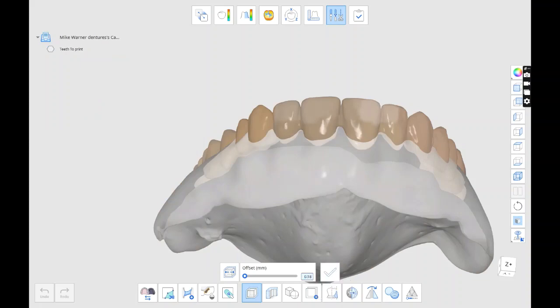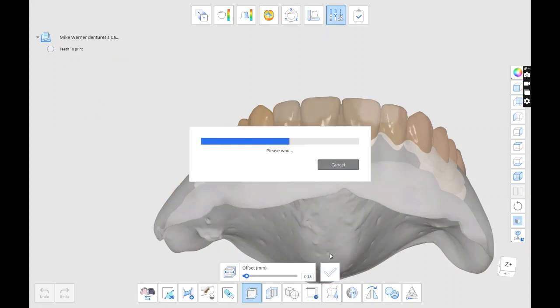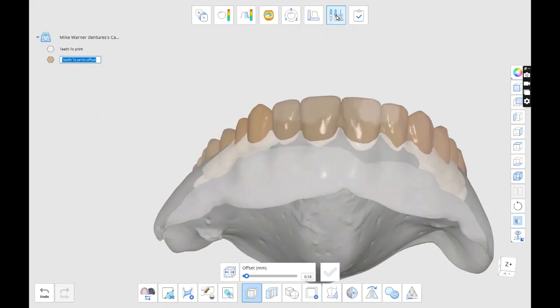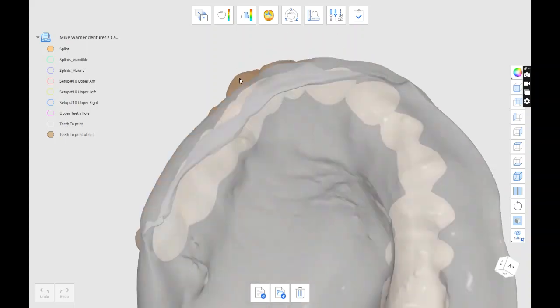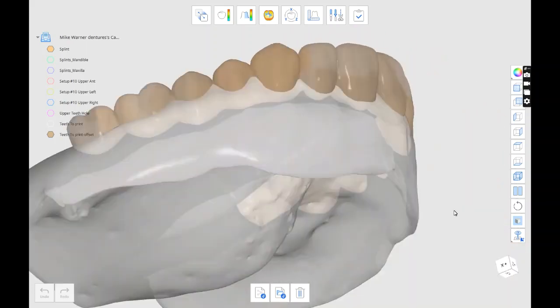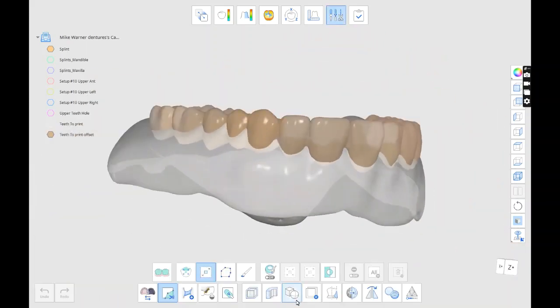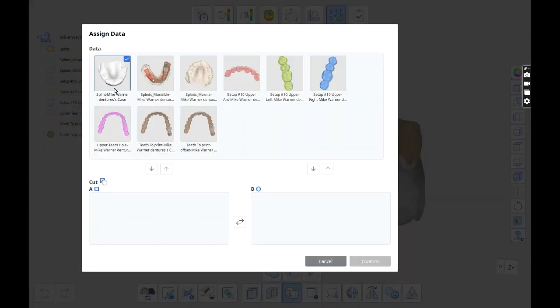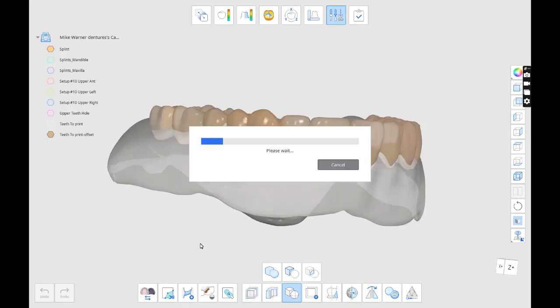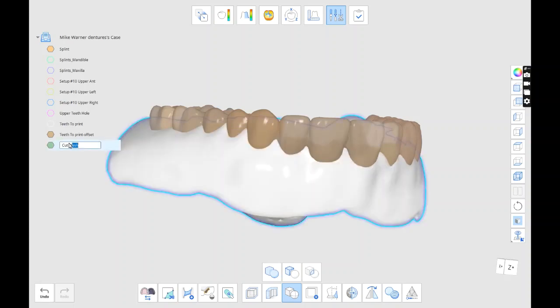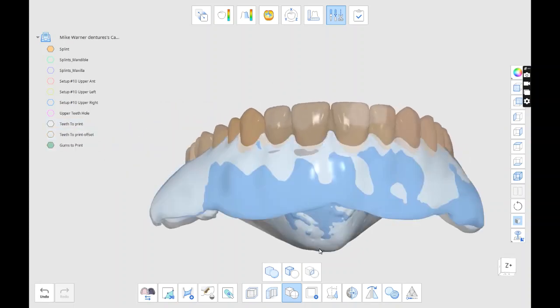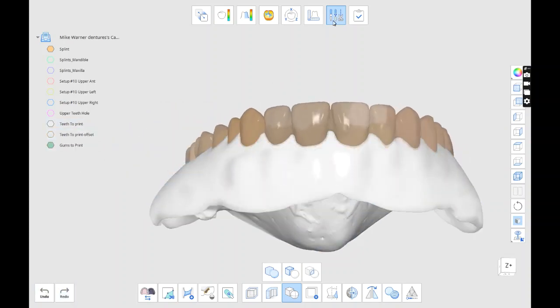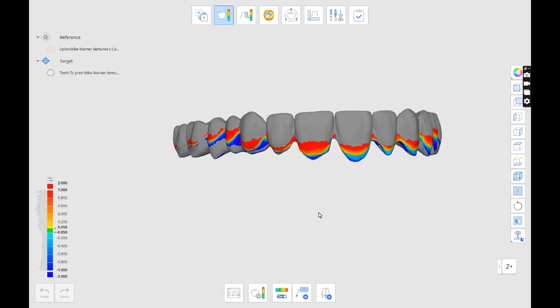Or actually, I'm going to cut away - do the offset right here of the finished teeth. And then we'll go ahead and cut that from the gums, and we'll export them. And this will be good to go ahead and start printing.